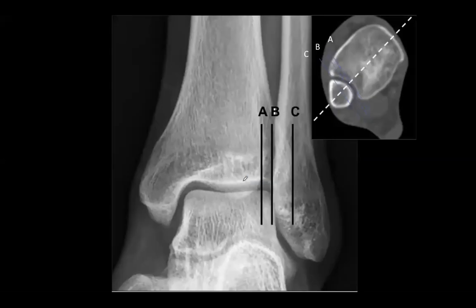All right, we just have a few more here before we let Nikki take over. When we get into looking at ankle fractures and syndesmotic injuries, we've covered this one before, but what do we call between A and B? What do we call that? Tibfib. Clear space. Overlap? Oh, sorry. No, that's okay. That's why we're going over this. The clear space is the more radiolucent area between the two bones, and the overlap is the more radiopaque area, where if you look up here is the anterior tibia overlapping the fibula.